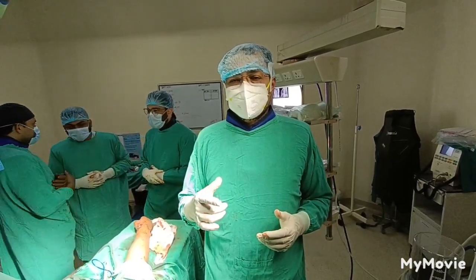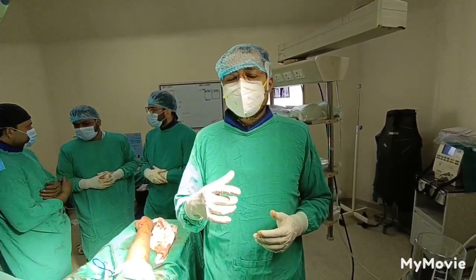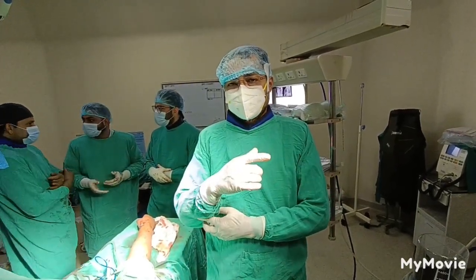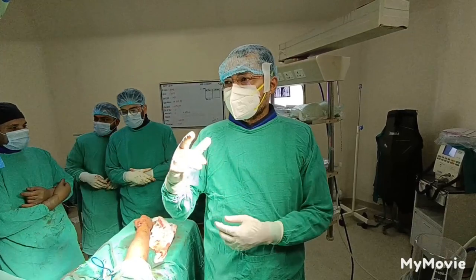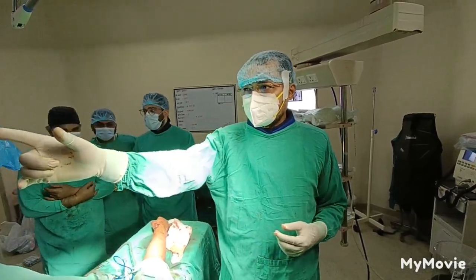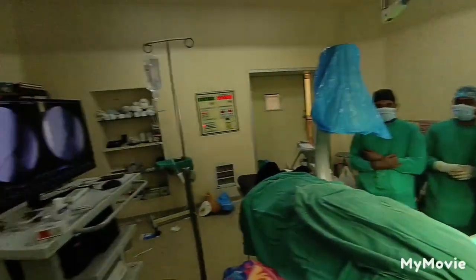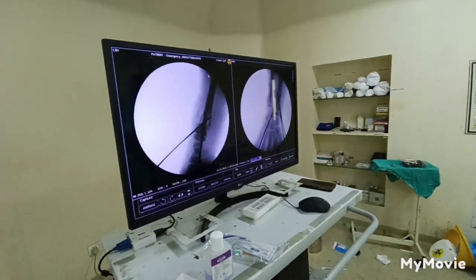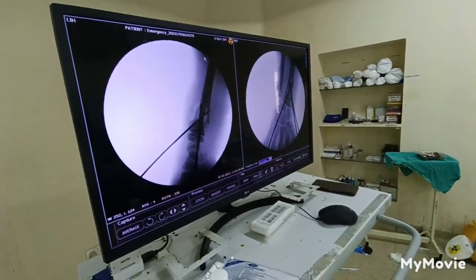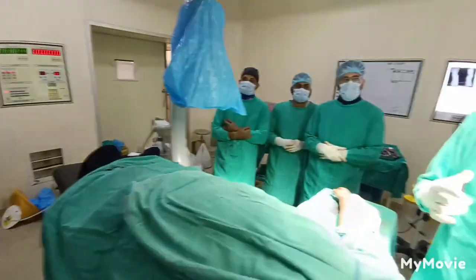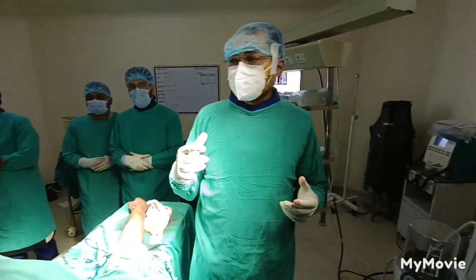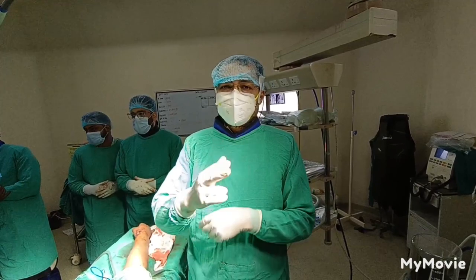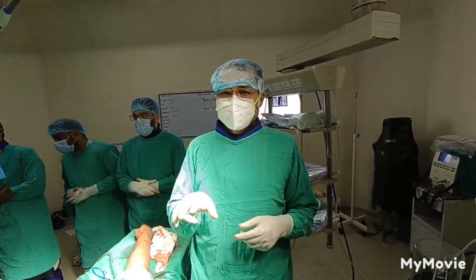So we did an anterograde TEN nail of the ulna. After that we obtained acceptable reduction. We then passed 3 K-wires — two from the radial styloid and one from the dorsal ulnar junction of the radius.